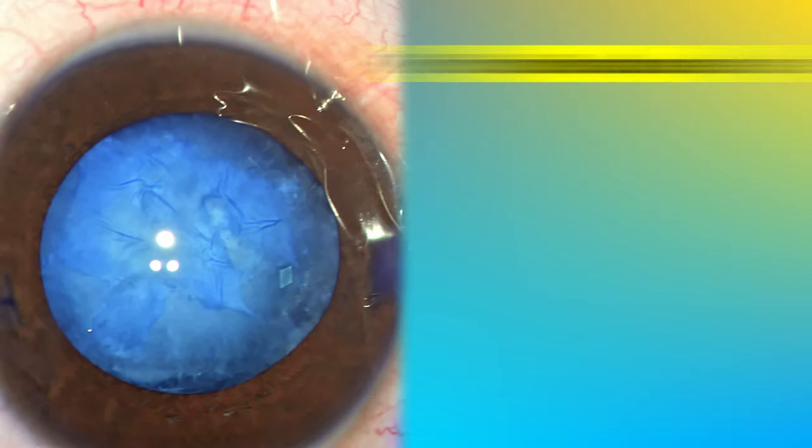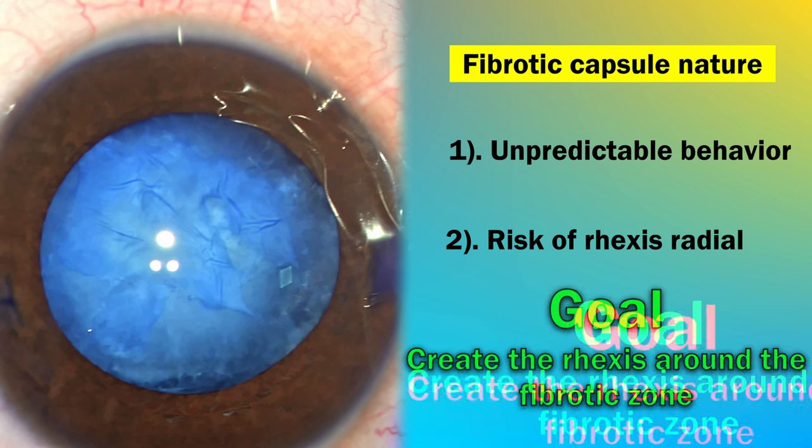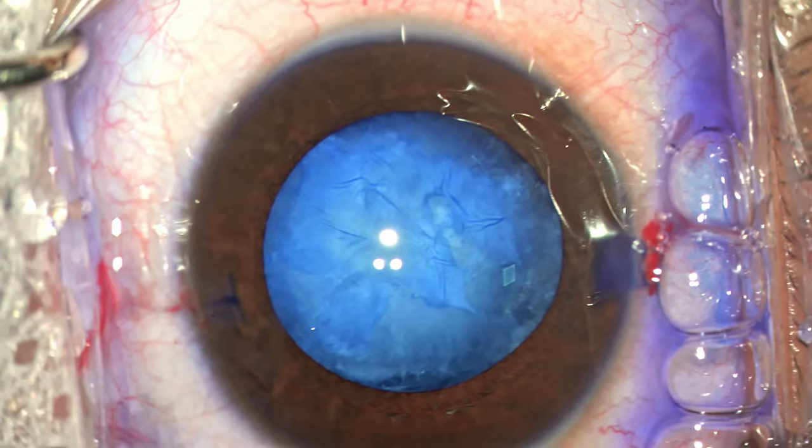The fibrotic capsule always behaves in an unpredictable way and it can run away to the periphery in an uncontrolled manner. We can't tear through the fibrotic zone, so my goal is to go around it and hopefully achieve a rhexis, although it might be a little bit eccentric. Let's see how things turn out.